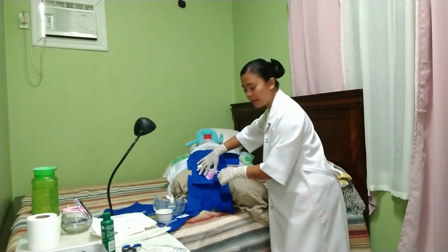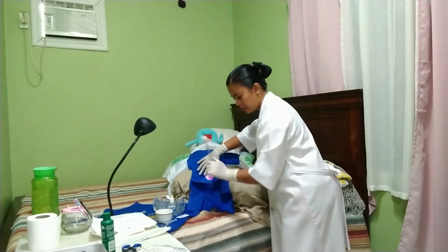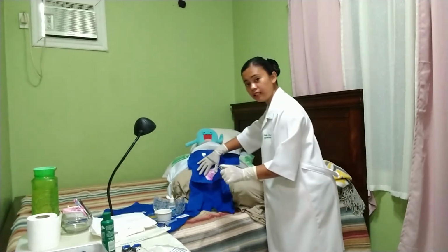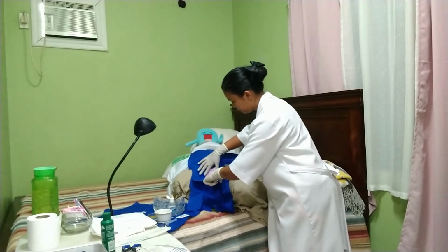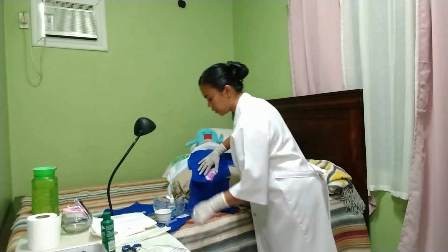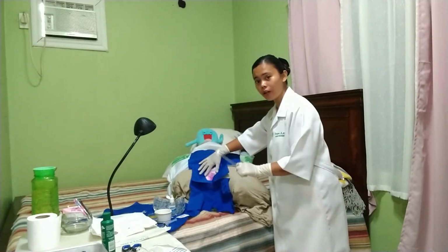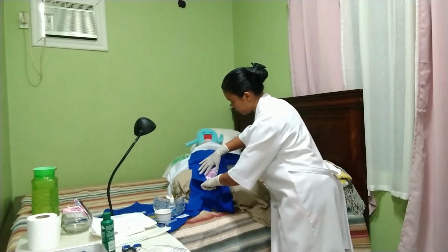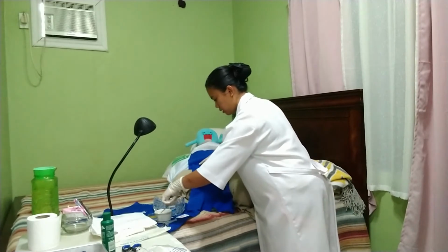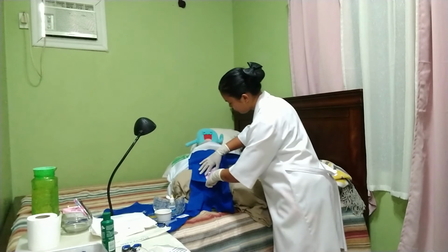Starting from the far labia majora, downward, discard, clean the near labia majora, still from top to bottom, discard the used cotton ball, then wipe the far labia minora from top to bottom, then followed by wiping the near labia minora from top to bottom.